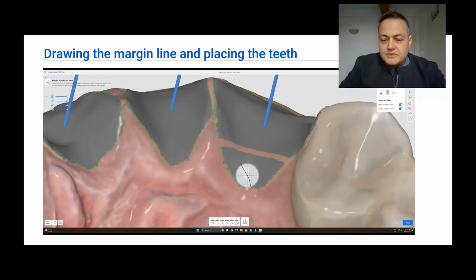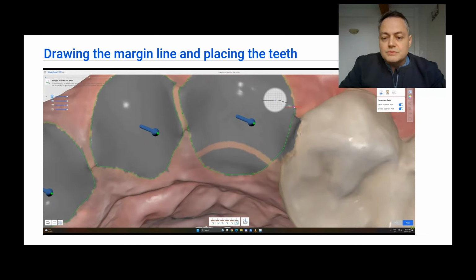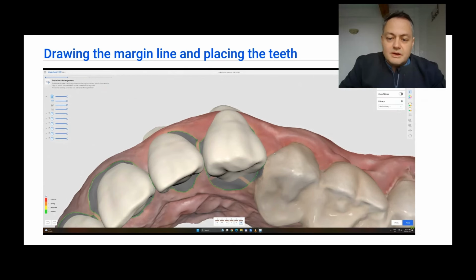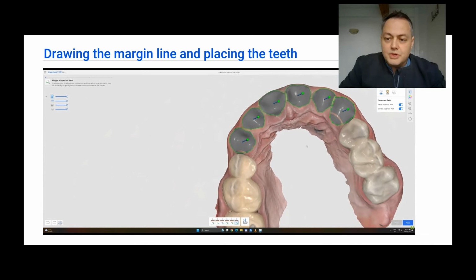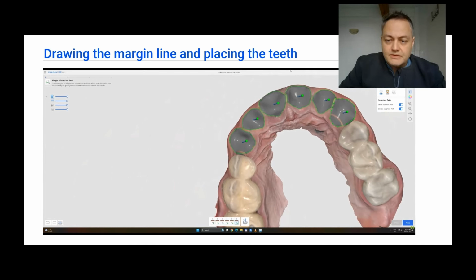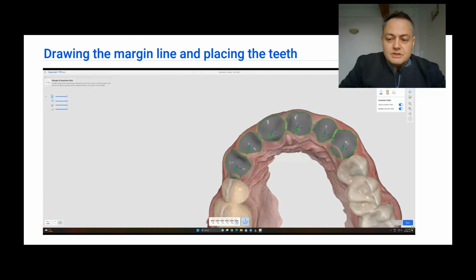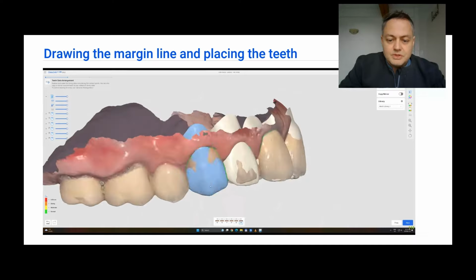And also here, in the previous step, it is very important to actually smooth and cut out the generated gray surface from the mesial parts of the teeth in the back. Now the program is going to first generate an insertion path, and we are going to use a bridge insertion path, or common insertion. Try and get it so that it actually allows the fitment of this virtual bridge between the mesial parts of the posterior teeth.